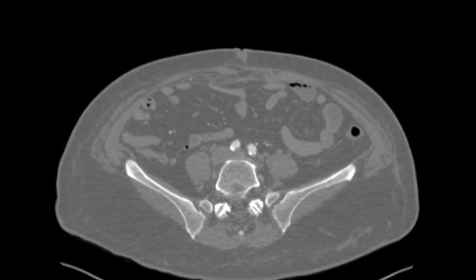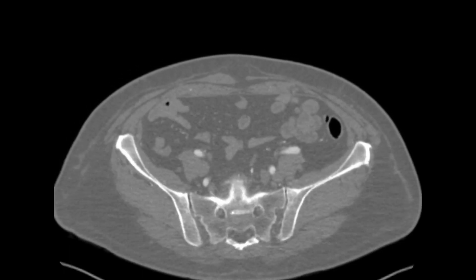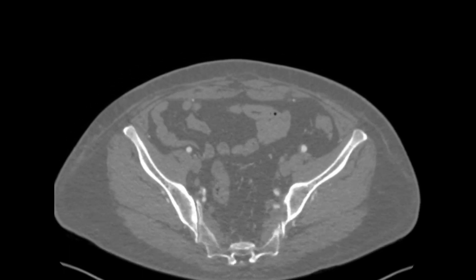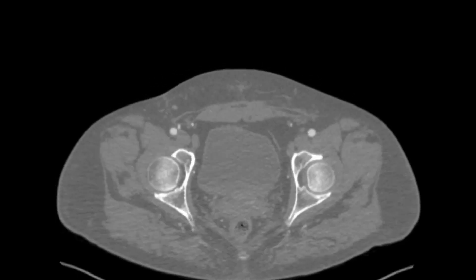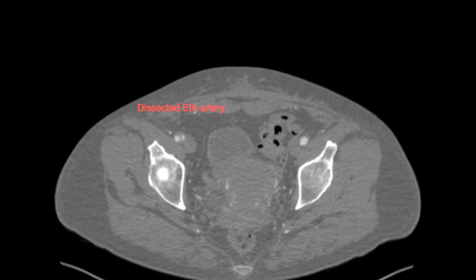She had a CTA of the chest, abdomen, and pelvis performed that demonstrated this dissection in the external iliac artery. This led to a high-grade stenosis resulting in lifestyle-limiting claudication.